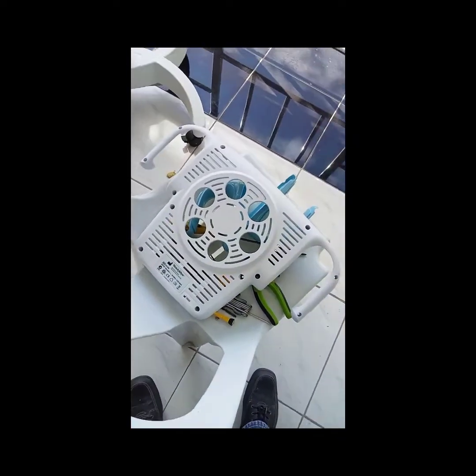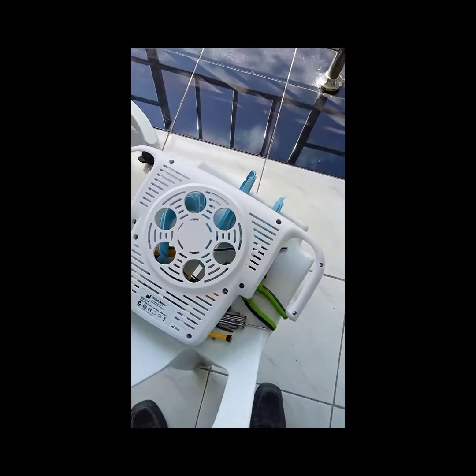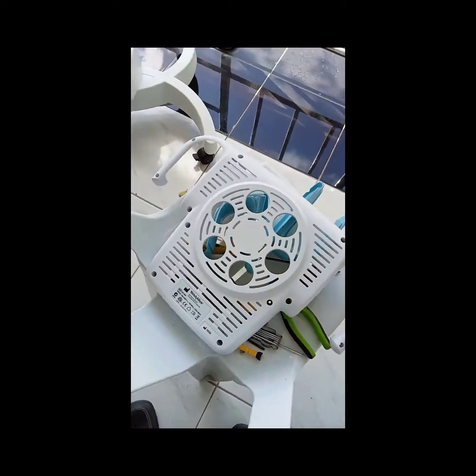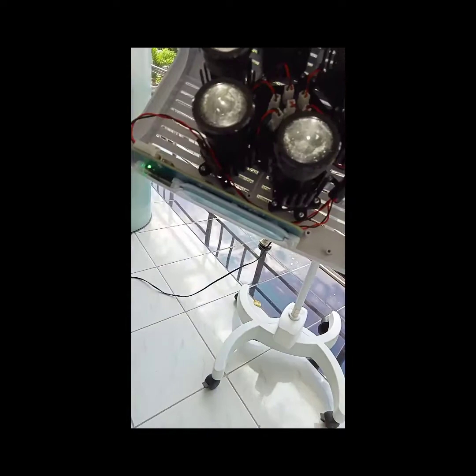Good day Biomed. I have here a portable surgical light made by Welch Allen. It is a touchless type portable.